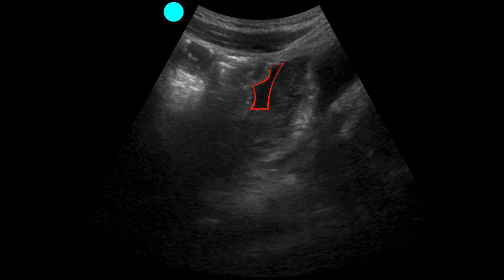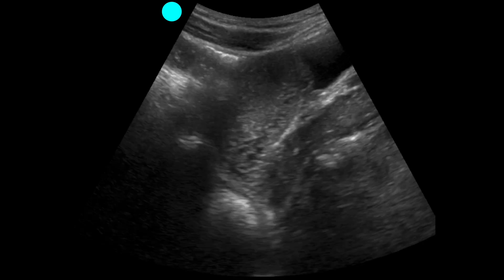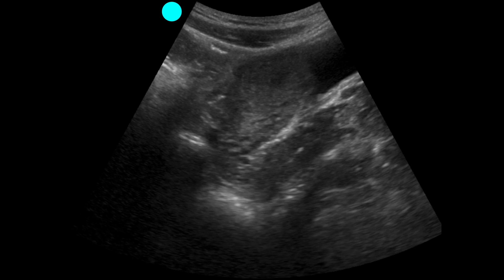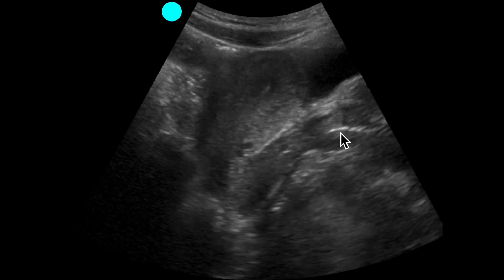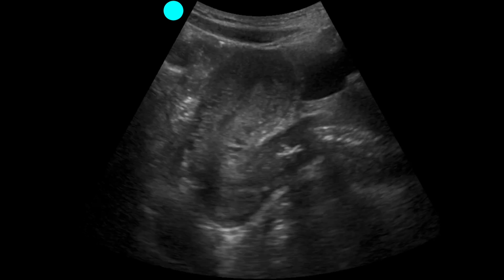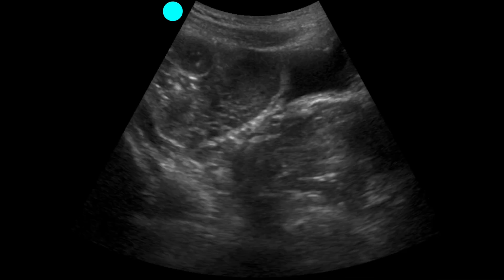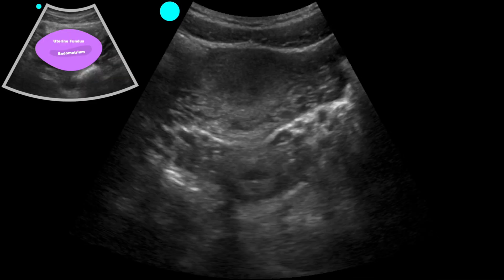We're scanning from right to left. We see more of the uterus come into view, and we start seeing the cervical stripe and vaginal stripe, with a little bit of the endometrial stripe coming into view. We also see an area posterior to the uterus consistent with more free fluid. Moving toward the farthest left extent of the uterus, on this quick exam we did not see any intrauterine contents consistent with a gestational sac.